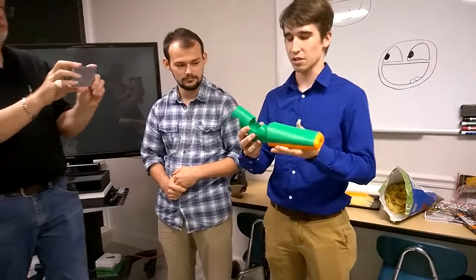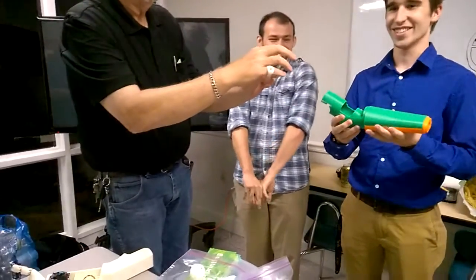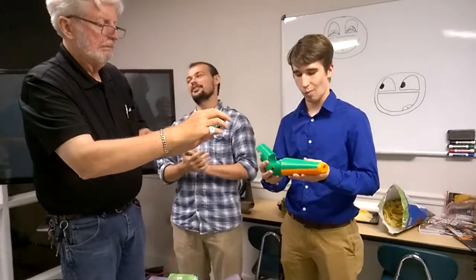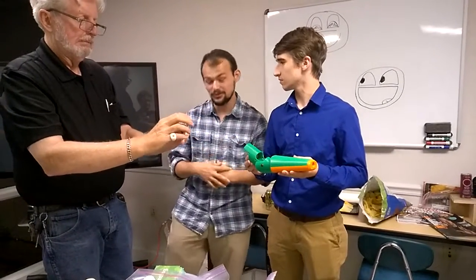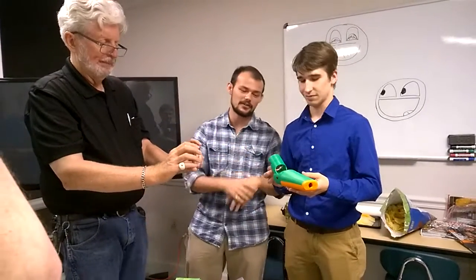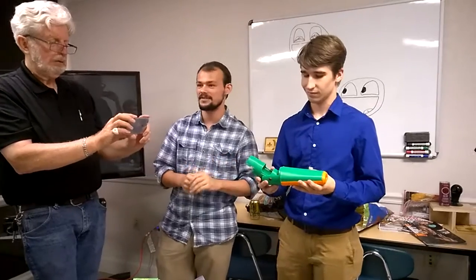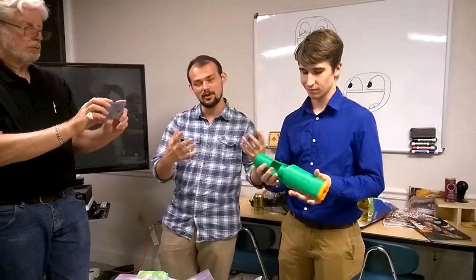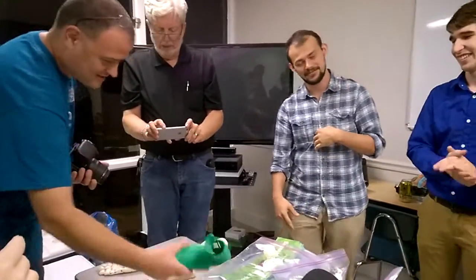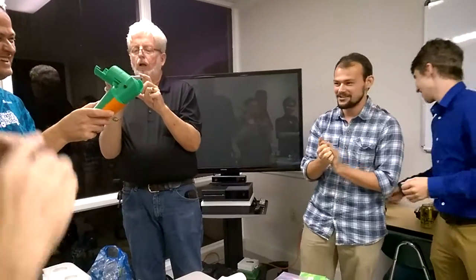I don't know why we did Miami colors — or Gators. Stratasys, while their quality is amazing, their cartridges and proprietary use of those filaments can be rather expensive. This was developed by one of our team members on their home 3D printer. $30 for a cartridge of filament is much better than $260 for a cartridge of filament. That's why we get some of these strange colors in our early prototypes.